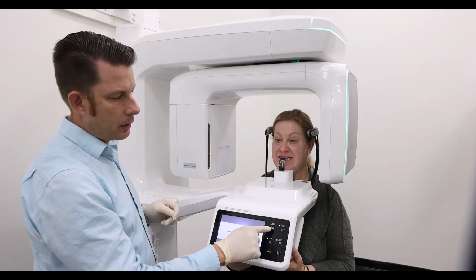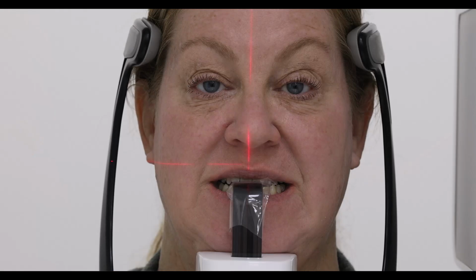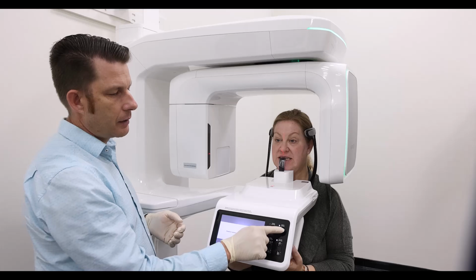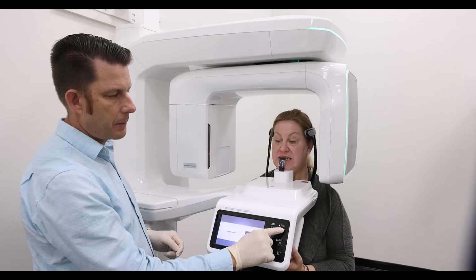Next, I'm going to go ahead and click on my temple support button to close my temple supports, double checking that the patient is lined up center. And finally, I'm going to click my ready return button here on the right side of the touchpad or right here in the middle. So in this case, I'm going to click here.